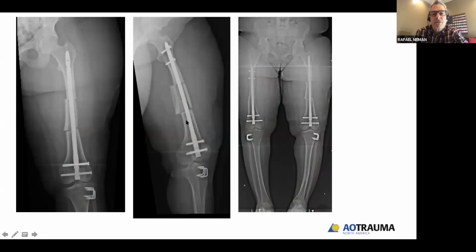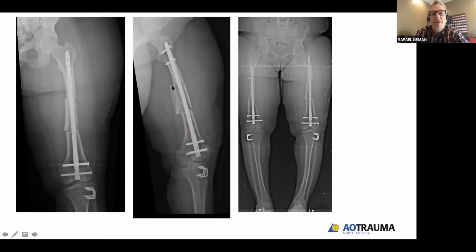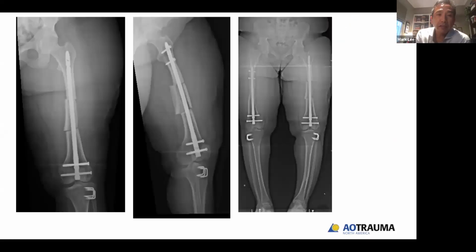Is anybody concerned with the wide displacement of that clamshell in the center? No. No. No. So as long as you have reamings in the transverse portions of this, and you leave that comminuted segment, just like a transverse or a comminuted femur in acute trauma. It's what we can't see that matters most, Rafi.